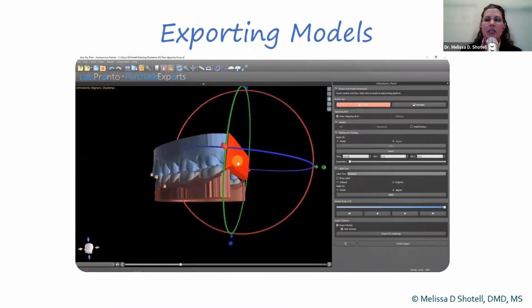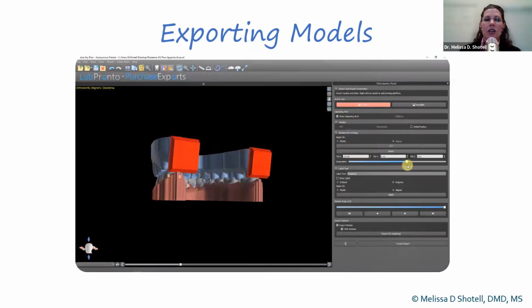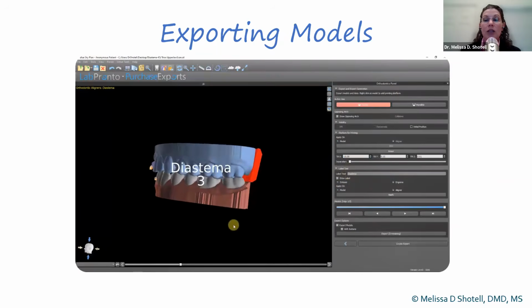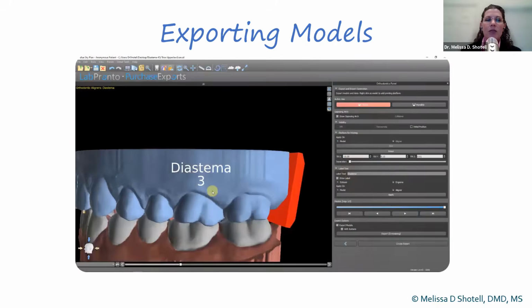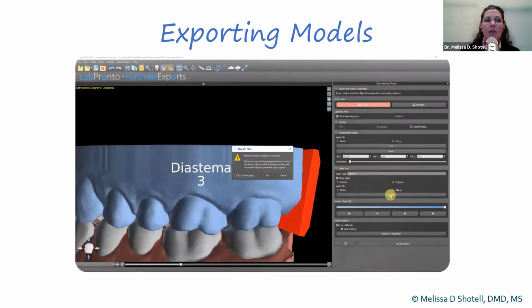We also have different functions available for printing either horizontal or vertical, and that is selected in this step as well. You can see here for your 3D printing preferences, a base can be added for vertical printing, and it can also be separated into 2 individual bases for saving resins as well. We're able to select a name for the patient models, and that can be placed with the step number on the individual models, either embossed or engraved into the models, so that these will be easy to identify in the laboratory.